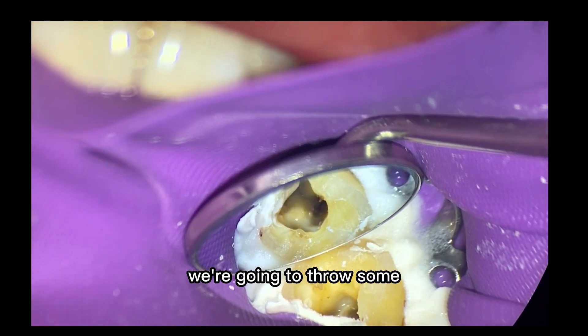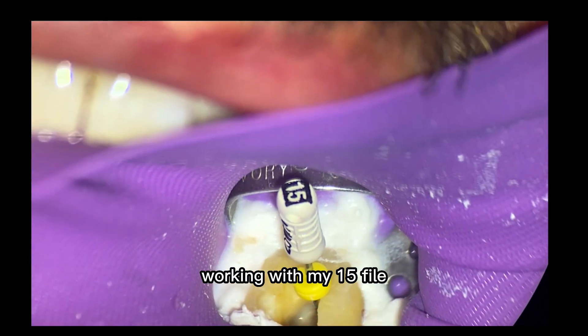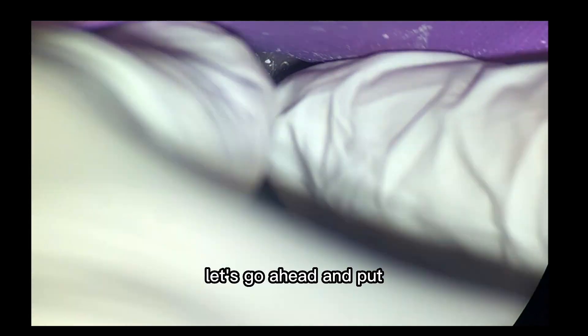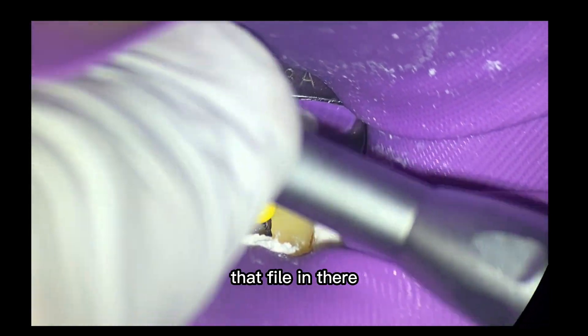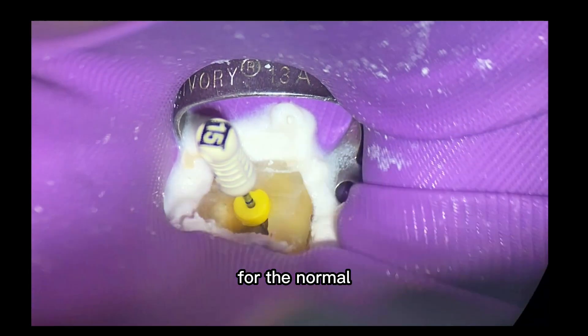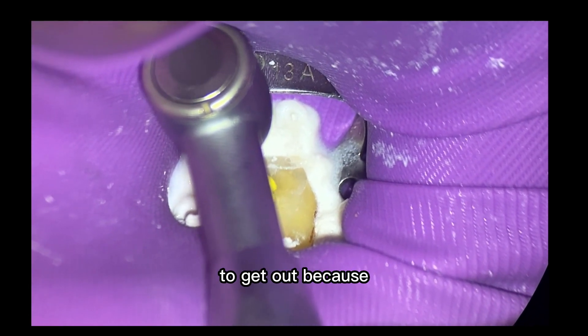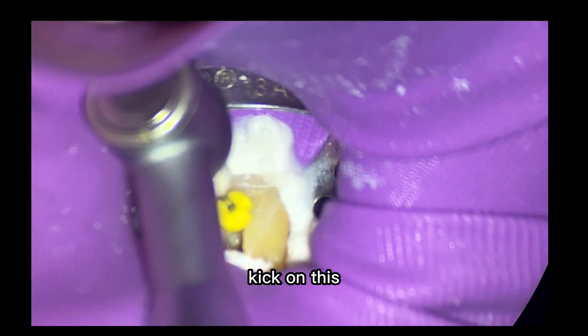We're going to throw some irrigant down there. We irrigated that out and then we're going to get our working length — I got my working length with my 15 file, but it was really tight to get that glide path. So let's go ahead and use the M4 reciprocating handpiece. I actually found it after it's been sitting for nearly six years somewhere in the basement. I used it in this case — it was really helpful. It was a pretty swift distal buccal kick on this canal.